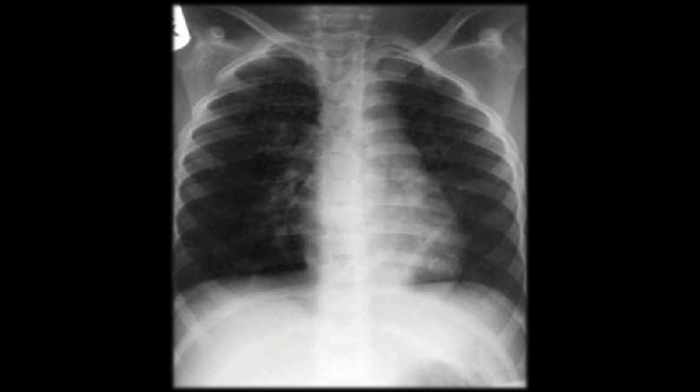You're given the chest x-ray. You sit there and look at it and notice a few hallmark classic signs of that obstructive lung pathophysiology. If we look at this from the RIPE mnemonic, number 1 is rotation. Is this patient rotated or are they symmetric? And I definitely feel like the patient is symmetric.